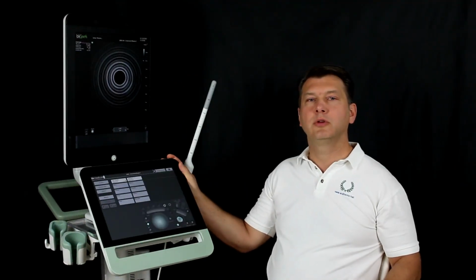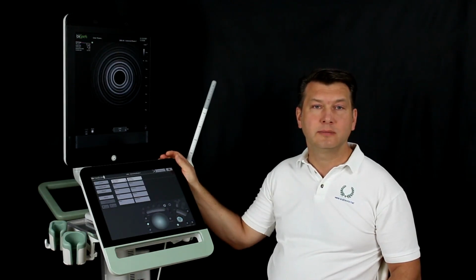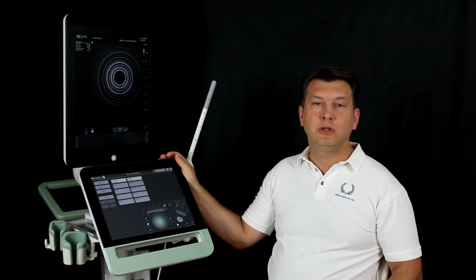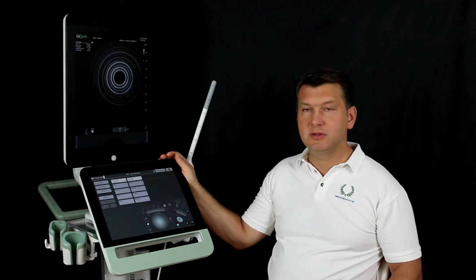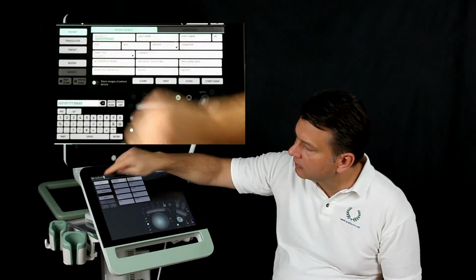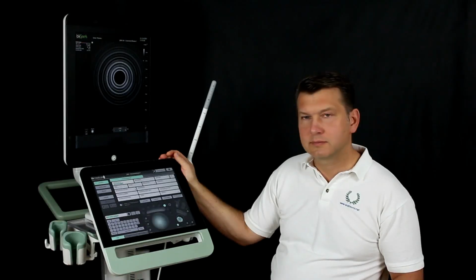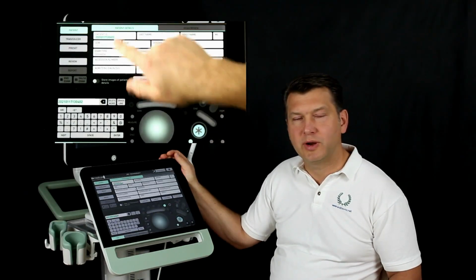In this video I show you how to operate the ultrasound scanner Specto from BK Medical. First we need to perform the input of patient ID. For this purpose, just press this button. We fill out these values and press Next.